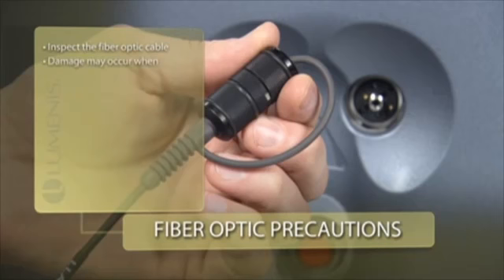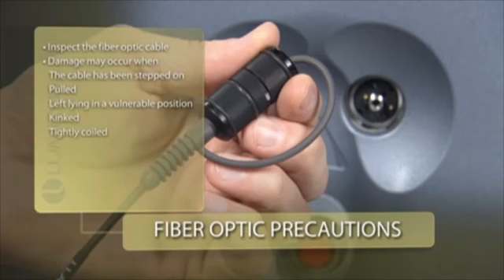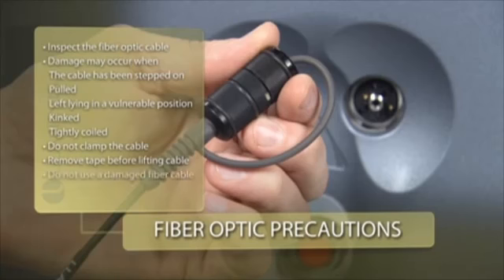The fiber optic cable may be damaged if stepped on, pulled, left lying in a vulnerable position, kinked, or tightly coiled. Do not clamp the cable with a hemostat or other instruments. If sterile tape is used, always remove the tape before lifting the cable. A damaged fiber optic cable may cause accidental laser exposure or injury to the treatment room, personnel, or patient.